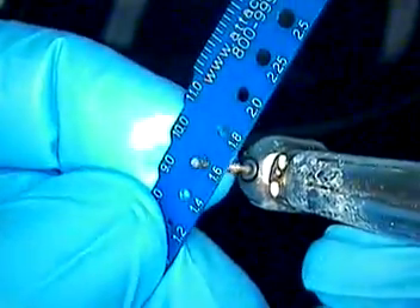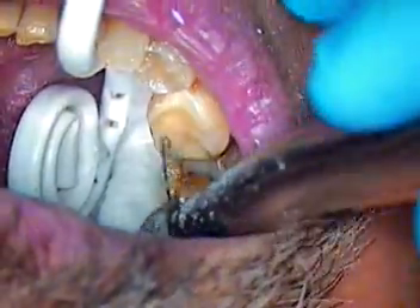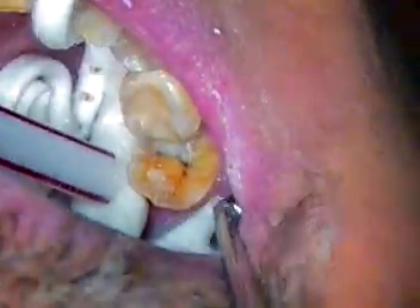Now if you look at the diameter of the burr, and if you have a gauge — 1.8 is here, here's 1.6, so we're right about 1.5. So anything greater than that is good. Minimum 1.5. If we can get to around 2 on the occlusal that will be good. And a taperedness to that.